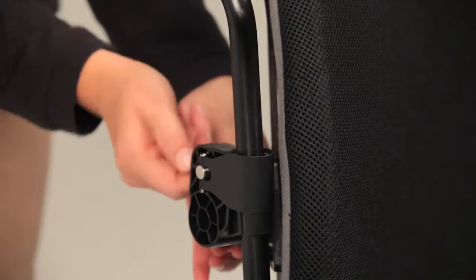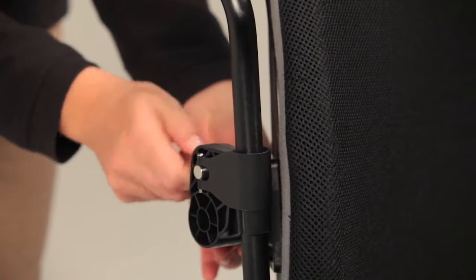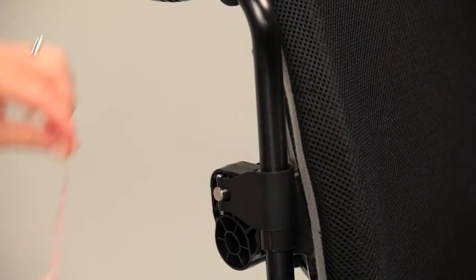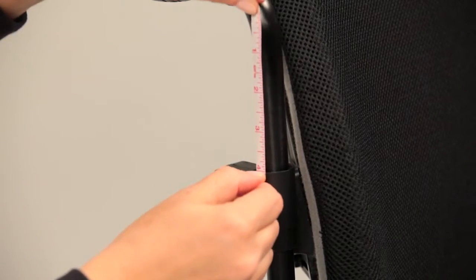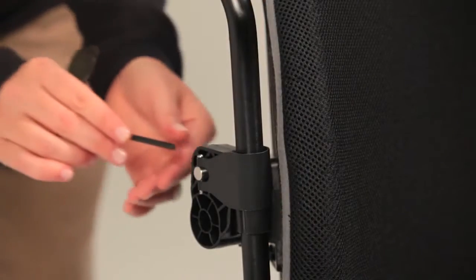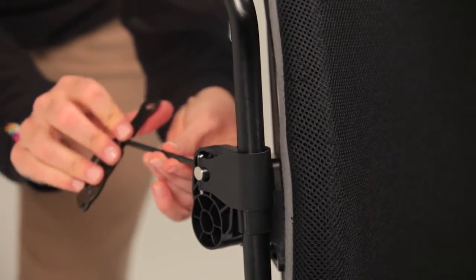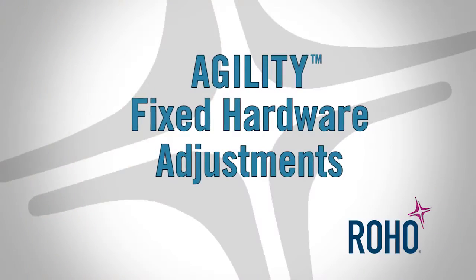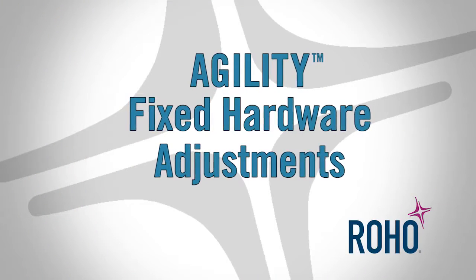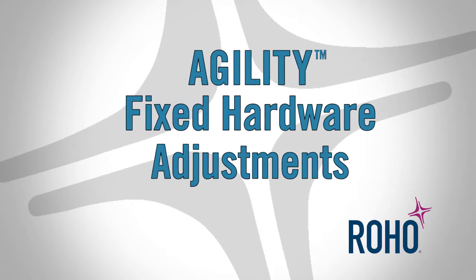Then tighten the hardware bolts on each side by hand to secure the back in place. Measure the height of both back cane bands with a tape measure and adjust as needed to ensure the backrest is level. Using the tool, tighten the hardware bolts until snug, plus a 1/4 turn. That completes the install. Once your Agility is properly installed, you can make any necessary height, depth, and angle adjustments.